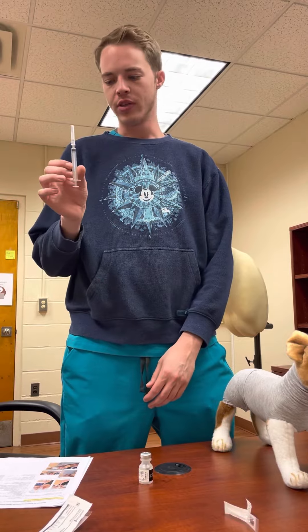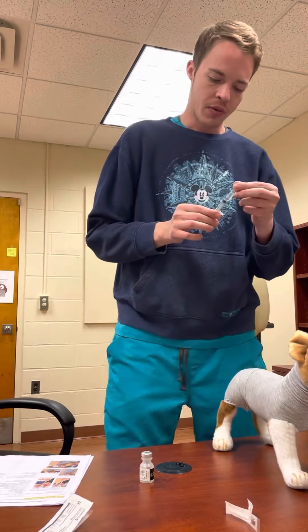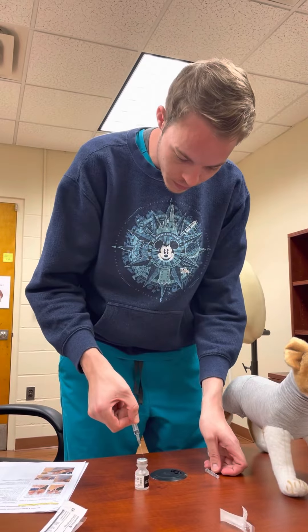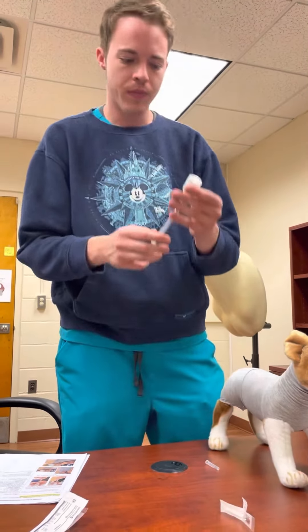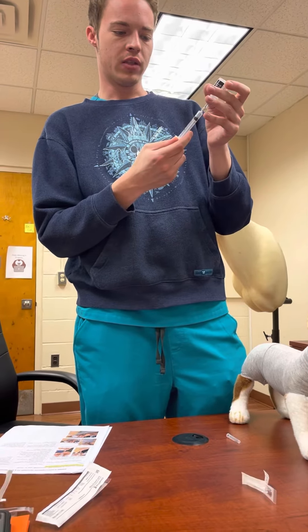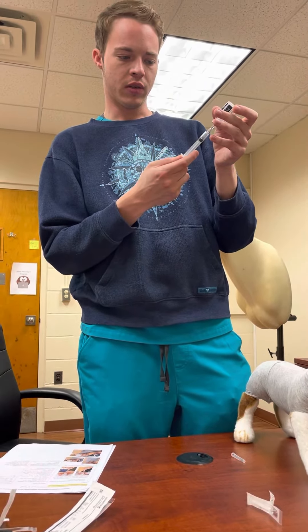We're here today to do the OSCE for giving a subcutaneous injection. The first thing you're going to do is take your needle-on-syringe that's already put together, uncap it, and poke the needle through the rubber stopper on the vial. Once we do that, we can invert the vial and draw back to draw up 1 ml of what is, in this case, air, but is representing a signifying solution.